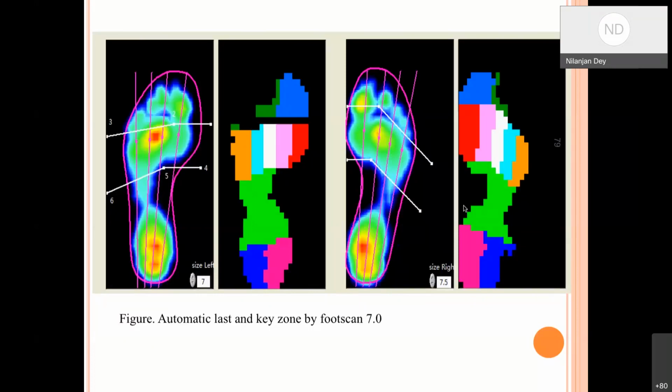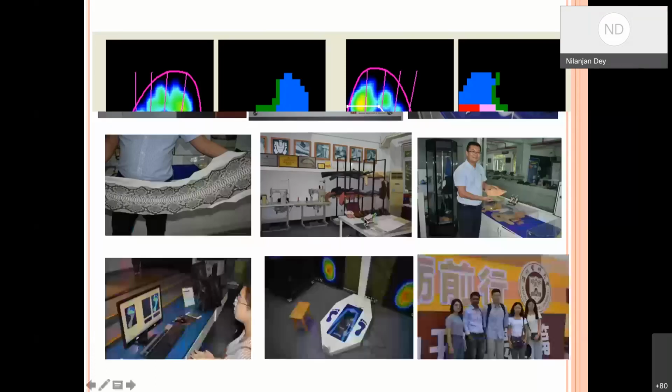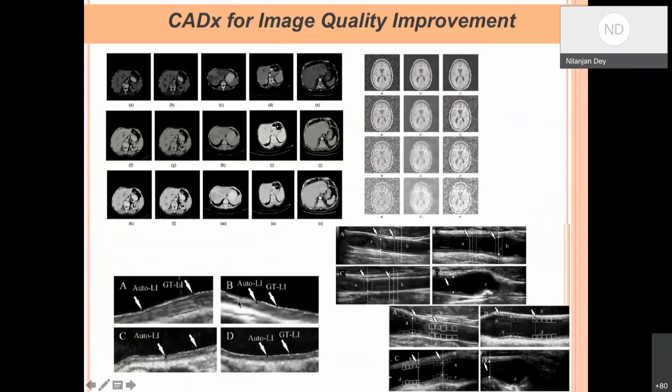Ophthalmic images also, for any ophthalmic disease: finding the macula, the optic cup to disc, and the blood vessels, extracting the vessel tree, as it is a biometric. For any ophthalmic disease it is always important to capture the vessel information. And as I already showed, the optic cup and disc can be found by a CAD system.